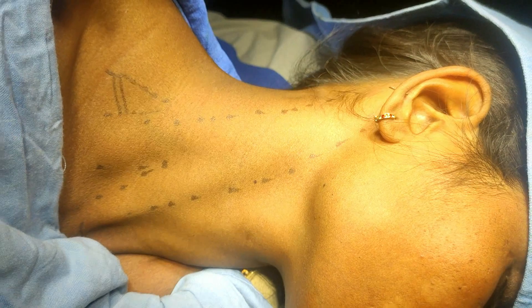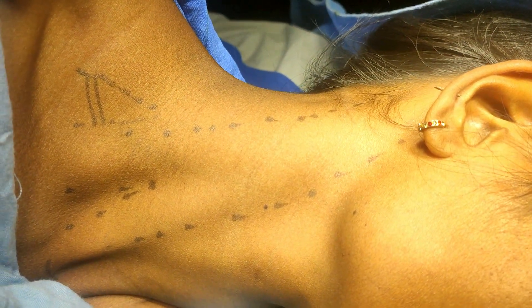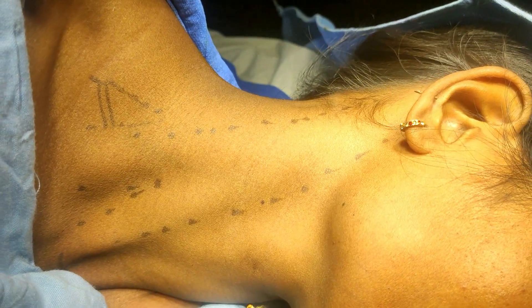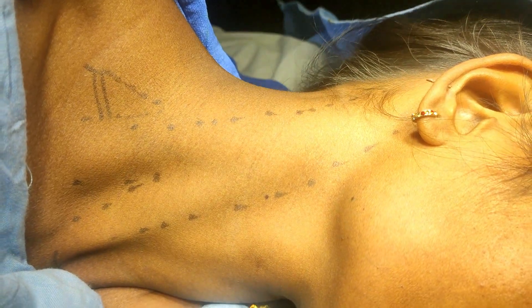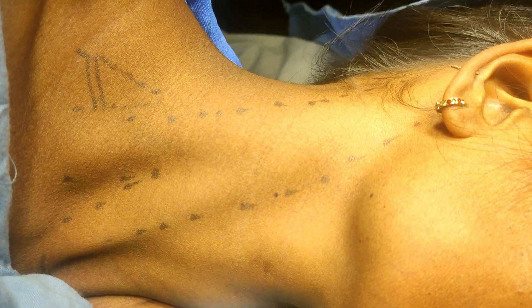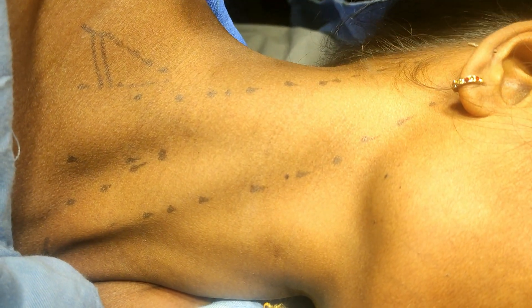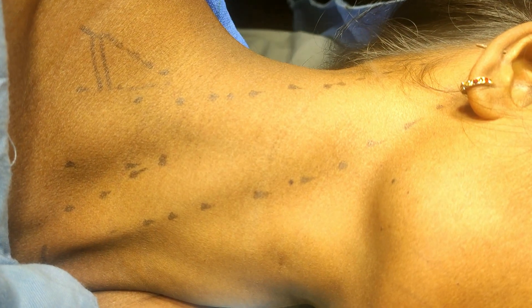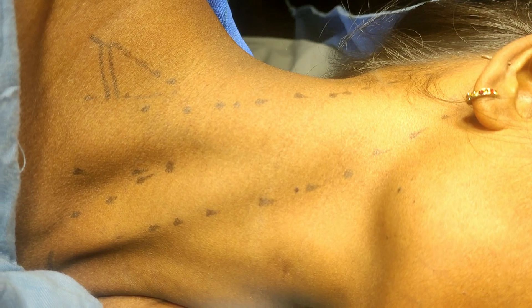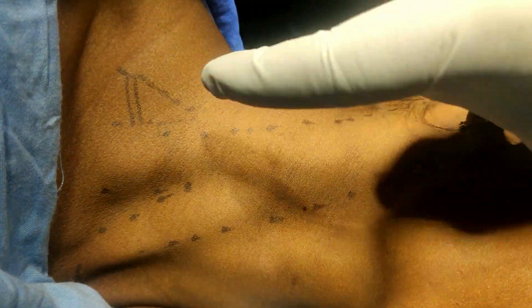This is a 20-year-old female with CRPS, or reflex sympathetic dystrophy. I am giving a sympathetic block from the posterior approach. This block also blocks the brachial plexus sympathetic system as well as the cervical plexus — so this is the posterior approach to brachial plexus, posterior approach to deep cervical block, or posterior approach to cervical sympathetic.